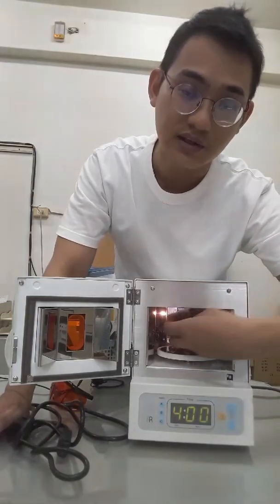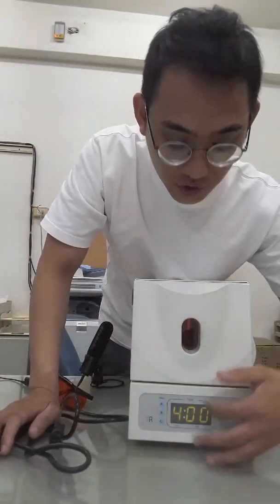When you put the item you want to cure inside, you close the door, choose your time, and press the power switch. Then the machine will operate.